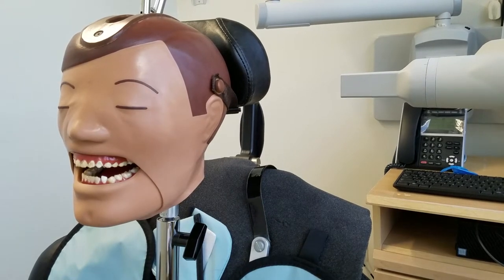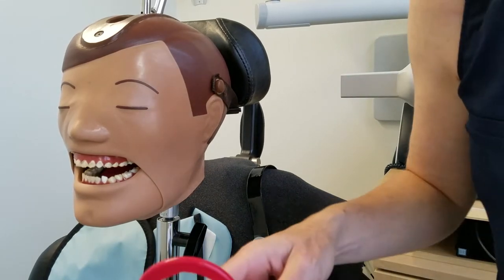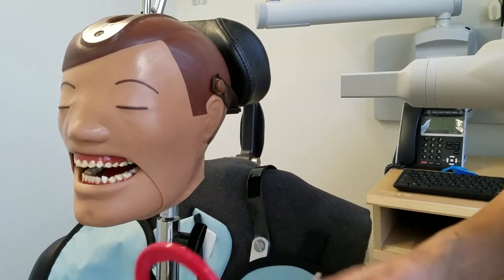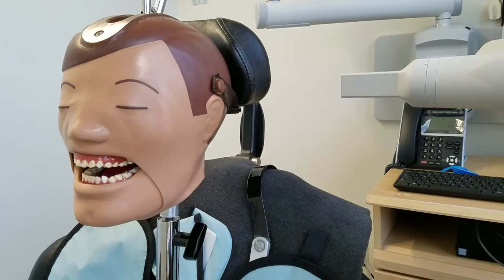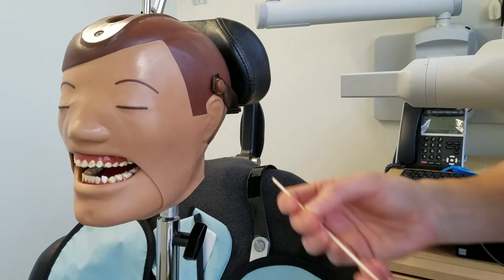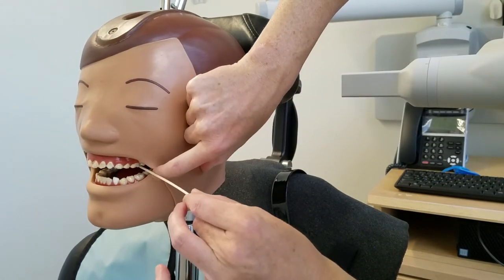Now we are going to do the molar bite-wing. What we're doing is horizontal, not vertical. With the molar, our key contact is between the first and second maxillary molar.